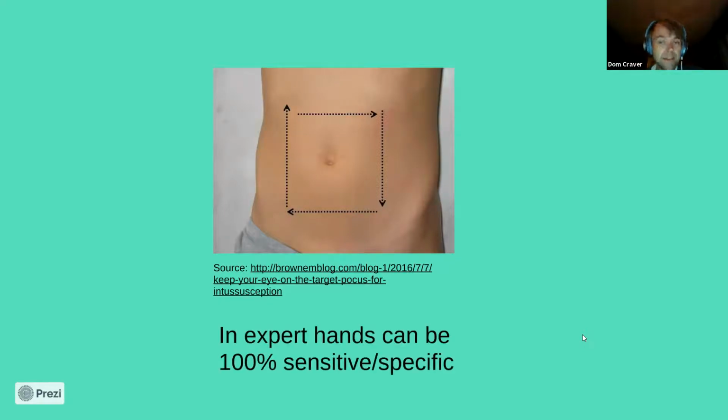And they say in expert hands, it's 100% sensitive and 100% specific. Obviously, we're not experts at this, but some studies looking at EM trained physicians that have only had an hour of training, the sensitivities have been in the 90s. So that's pretty good.